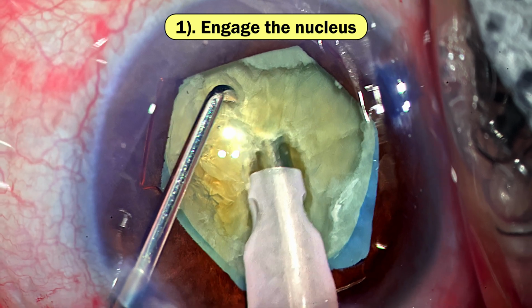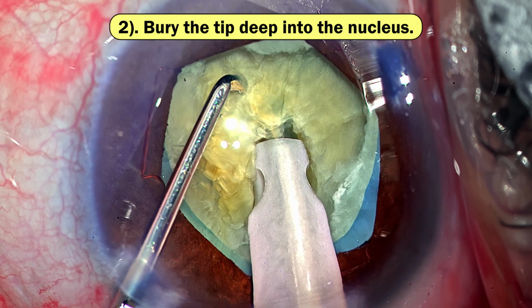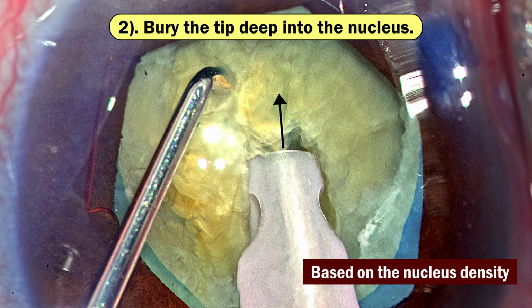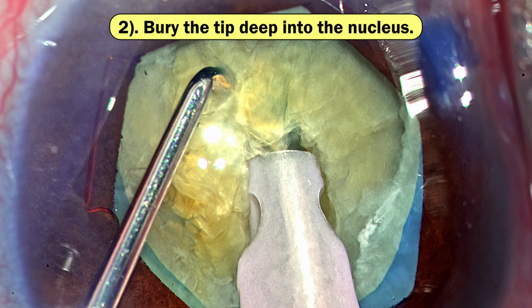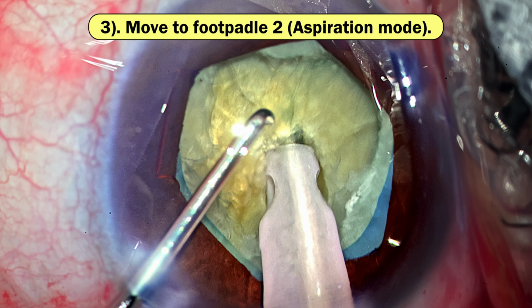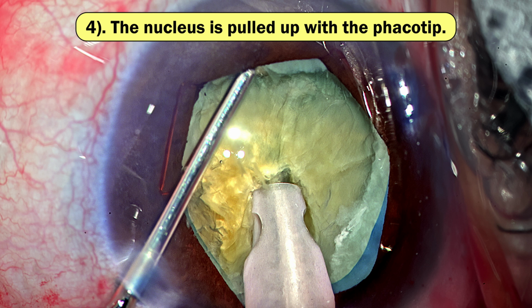This ensures that you're going to engage the nucleus. Then you need to bury the tip a little bit deeper into the substance of the nucleus depending on the density of the nucleus. This is step number 2. And once you've buried the tip sufficiently deep, then we're going to move to foot pedal 2, that is, just aspiration mode, just holding the nucleus there. Number 4, the nucleus is slightly pulled up with the phaco tip just a bit.